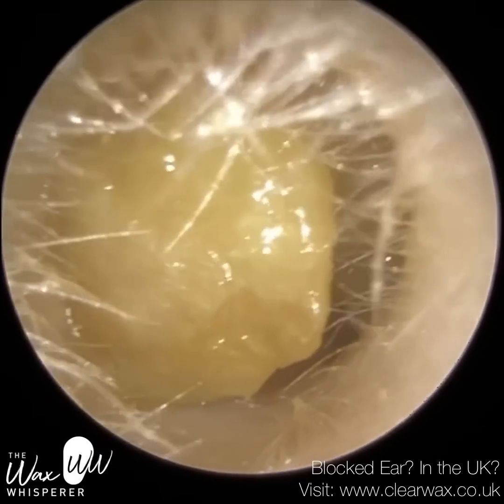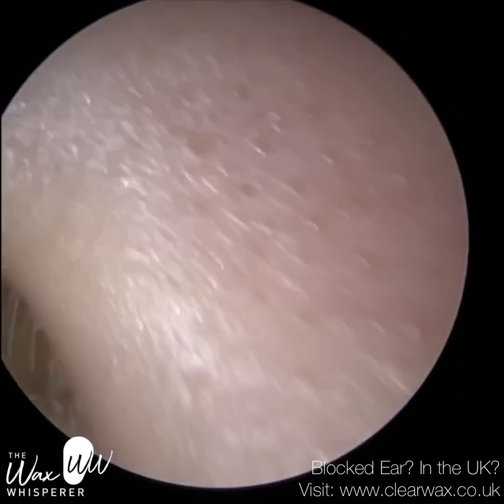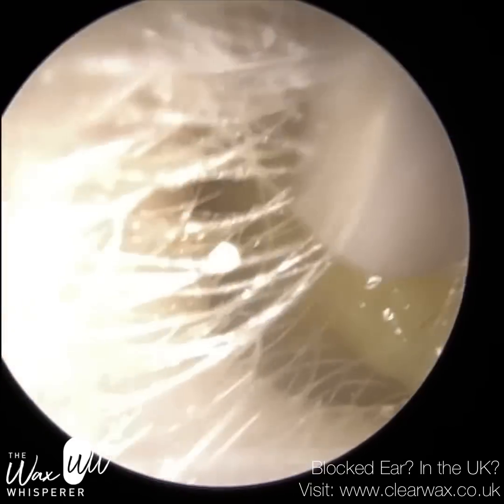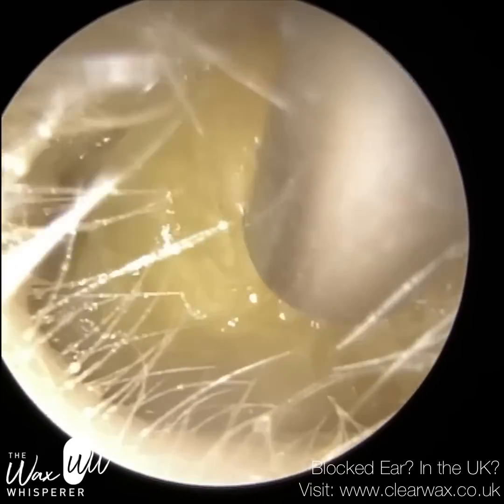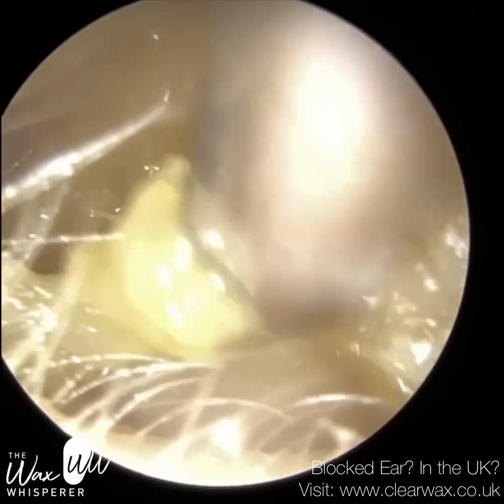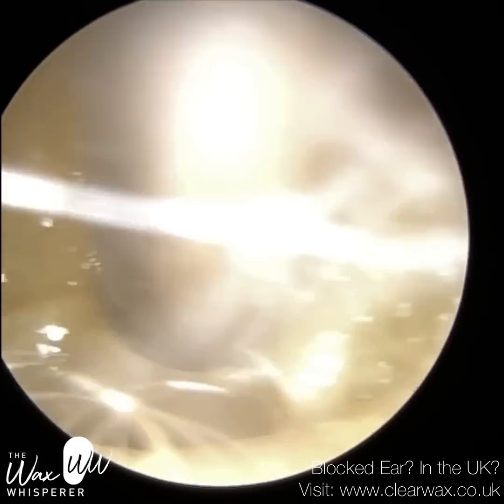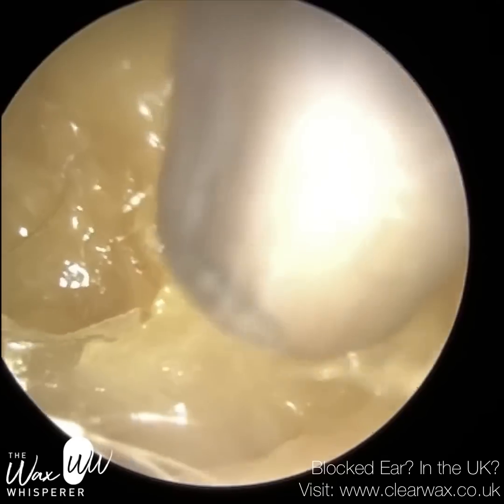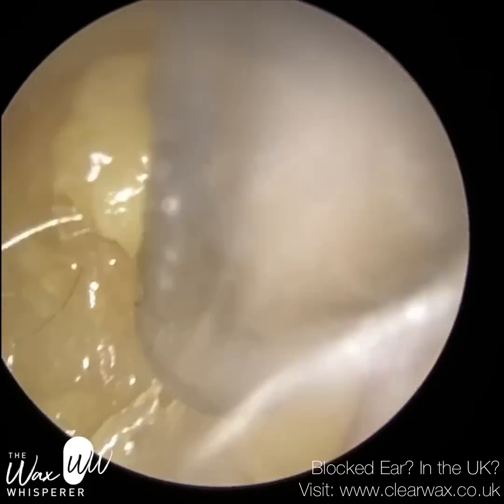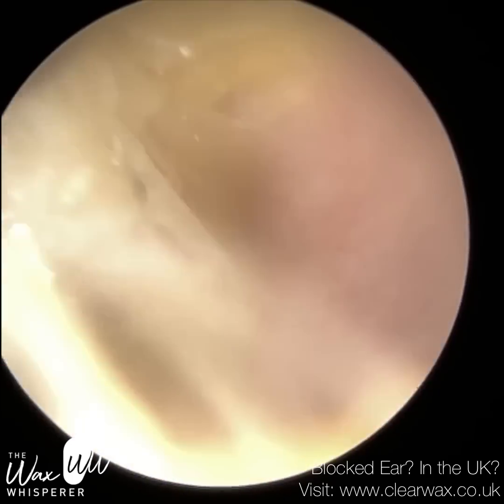We have here a couple of clients who attended with not only occluding earwax, but also underlying glue ear, which is a middle ear infection. Both patients are paediatric patients, around about 7 or 8 years of age. This is patient 1, and we're just cleaning out their left ear, which is fully occluded with soft wax and dead skin.